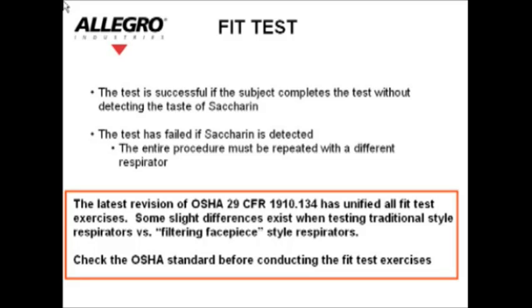The latest revision of OSHA 29 CFR 1910.134 has unified all fit test exercises. Some slight differences exist when testing traditional style respirators versus filtering facepiece style respirators. Check the OSHA standard before conducting the fit test exercises.